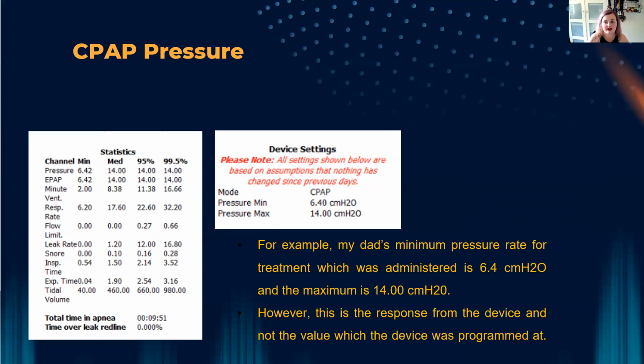If you look at the FDA's database, where patients complain specifically about medical devices, and where physicians also can complain, there were other manufacturers that had problems with pressure far exceeding what was safe, and patients had adverse reactions. So adverse reactions do occur in these devices. I'm not aware of any in this specific one, and I could correlate with my dad's data that he was receiving what was programmed and what was appropriate for his needs.